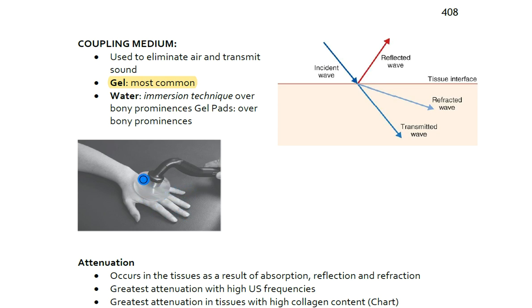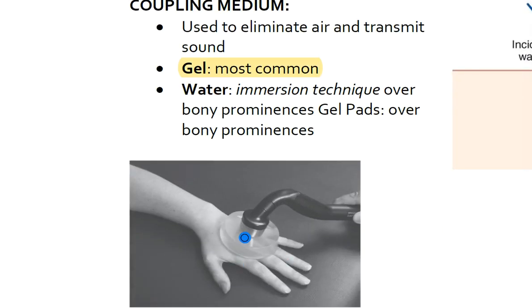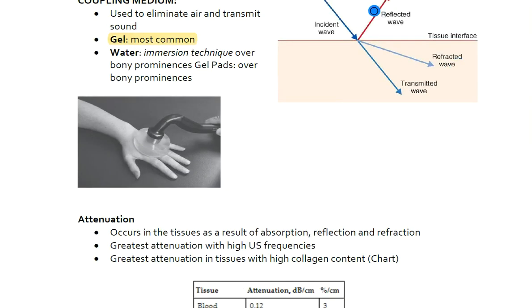One of the important things as you look at the transducer head is to make sure that it's parallel to the surface you're applying it to. And if it's not, it's going to go in different directions. So to have that at an angle, you're going to lose a lot of that acoustic energy. So you want to apply that parallel to the surface.